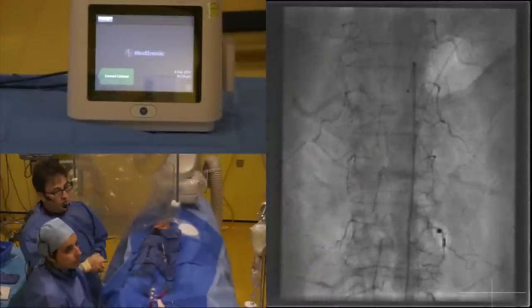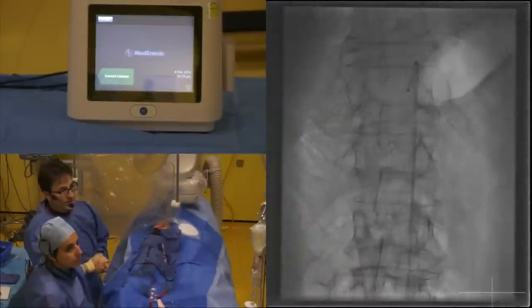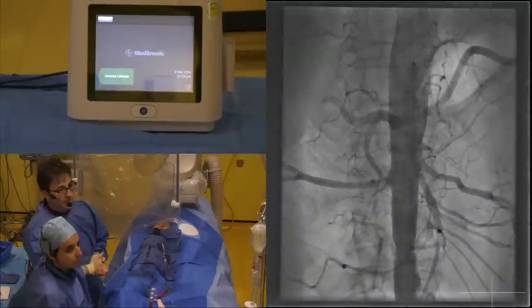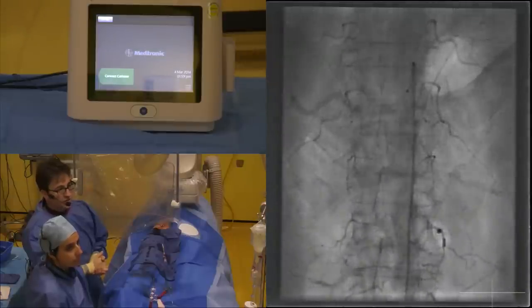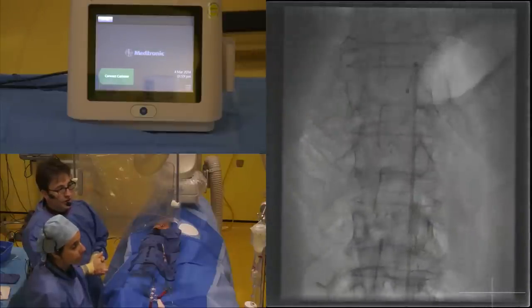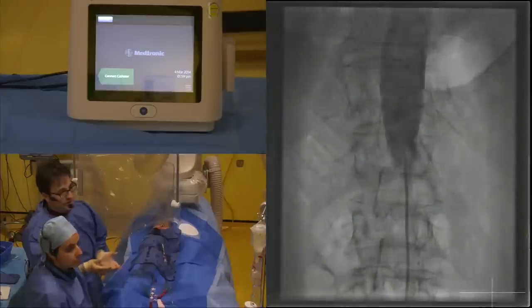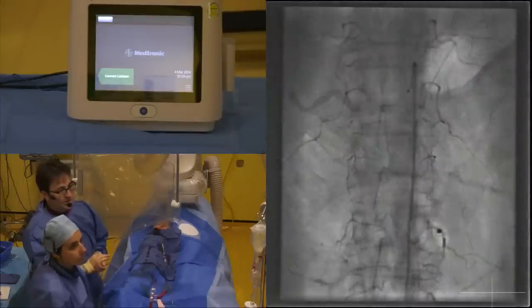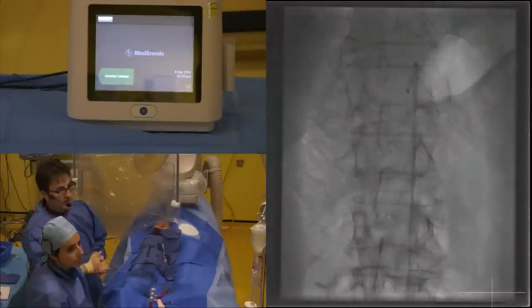You can see that this is a tortuous aorta again. An elderly gentleman, perhaps a little aneurysmal in the midsection there. He's got two renal arteries which are definitely atheromatous, probably three and a half millimeters each in diameter, so they're kind of low end of where we'd normally consider suitable.